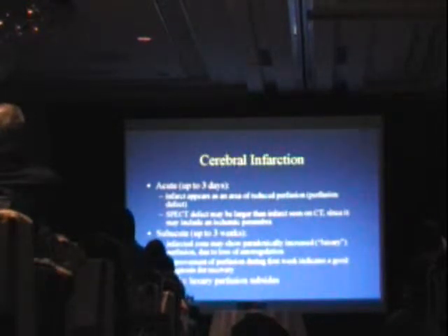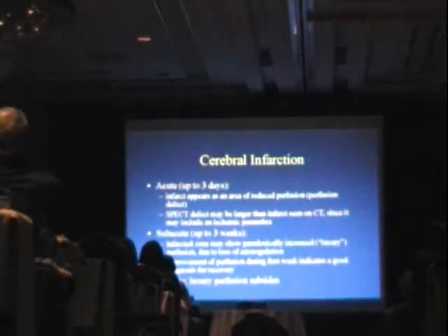Cerebral infarction, I'll start off with cerebral vascular imaging. Infarcts that are acute, that is up to 3 days, are seen, first of all, in our perfusion imaging scan. We can see that before anything on CT, so it's actually very useful for early infarcts.